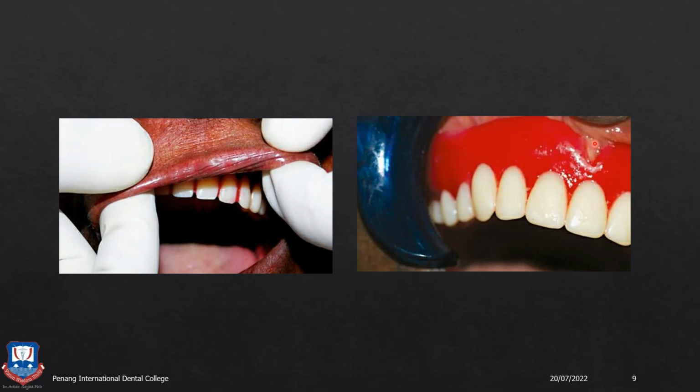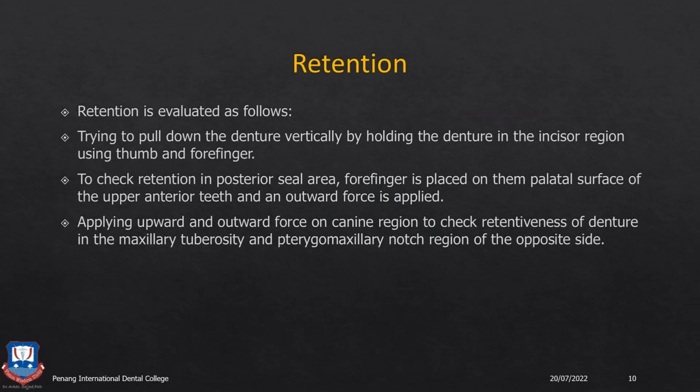All the proper frenum reliefs, like the buccal frenum and the labial frenum relief, should be given at this trial denture step, so that you show that the peripheral and the relieving structures have been properly and accurately recorded in the previous step. And of course, you also check for the aesthetics such as fullness, labial fullness, all these things.